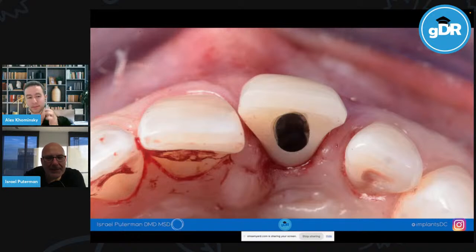So what happened here? What would you think happened? I think your lab's gone for an out of occlusion approach. Could be.